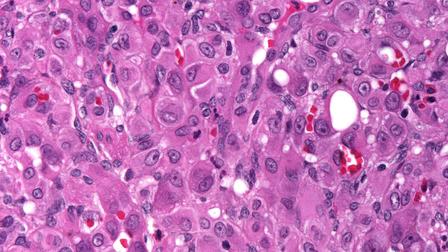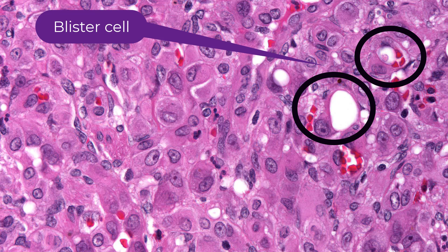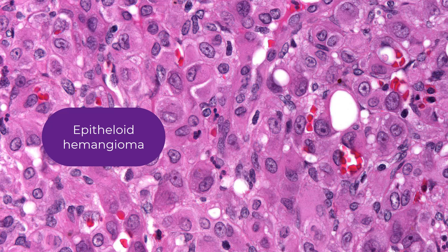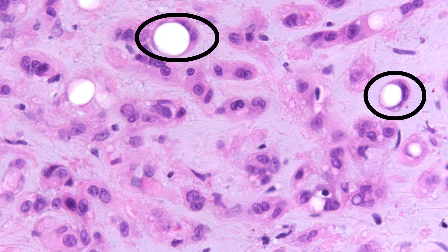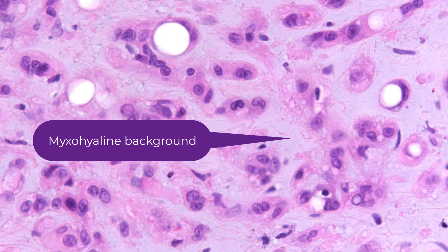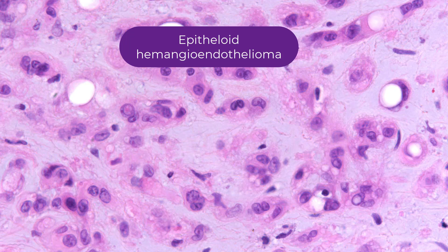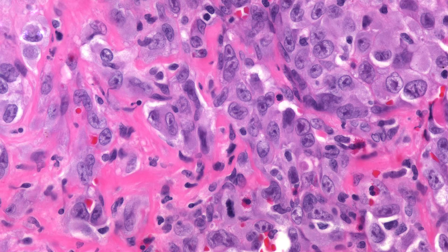Consider this tumor: epithelioid cells with abundant eosinophilic cytoplasm, perhaps some grooves — but look at that blister cell. This is an epithelioid hemangioma. Another tumor has cells with abundant eosinophilic cytoplasm and grooves, but there are blister cells (vacuoles specifically) and a myxohyaline background — this is an epithelioid hemangioendothelioma.